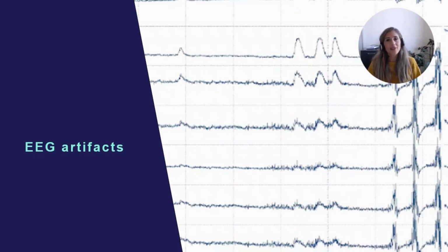Luckily, the artifacts are easy to spot because they have a particular shape. Blinking or eye movement creates these large waves. EMG activity, so muscle contraction, creates these sharp, irregular, fast spikes, while noise, for example from the electric supply, usually creates very regular waves in the signal.